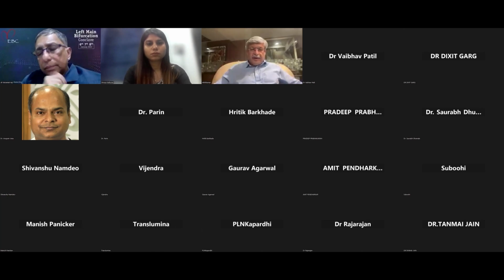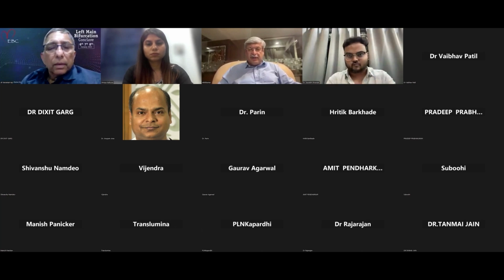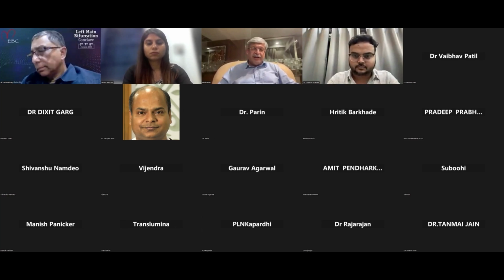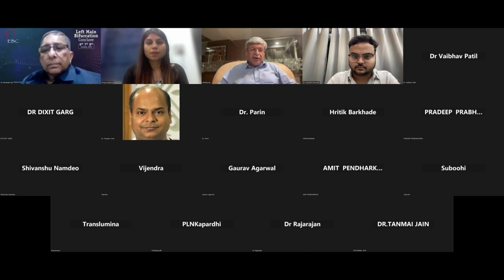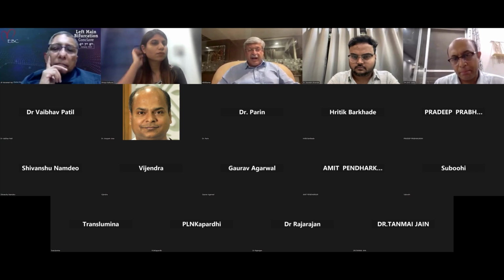Yeah, so taking the nodule first, I think management of a nodule can be very, very difficult. And sometimes you can have no strategy which would manage a nodule. So that's a different thing. But the only comment I have is that once you've seen calcium, I would personally go ahead with deciding on the plaque modification and management of calcium before trying to manage it with a balloon dilatation.